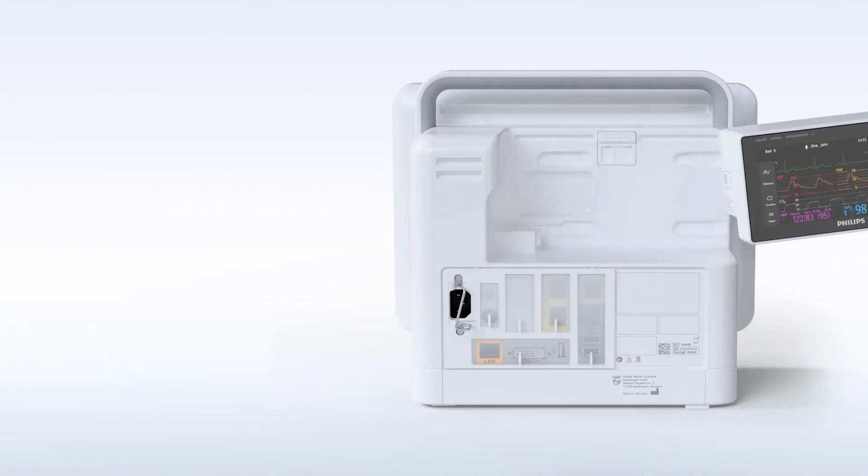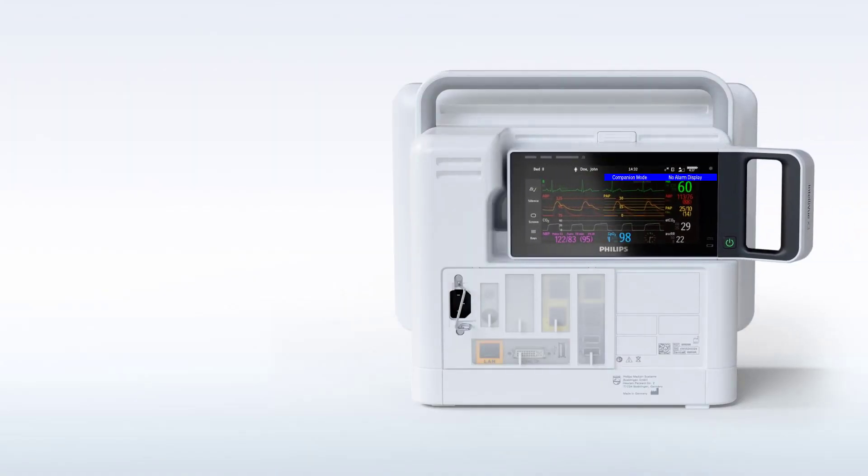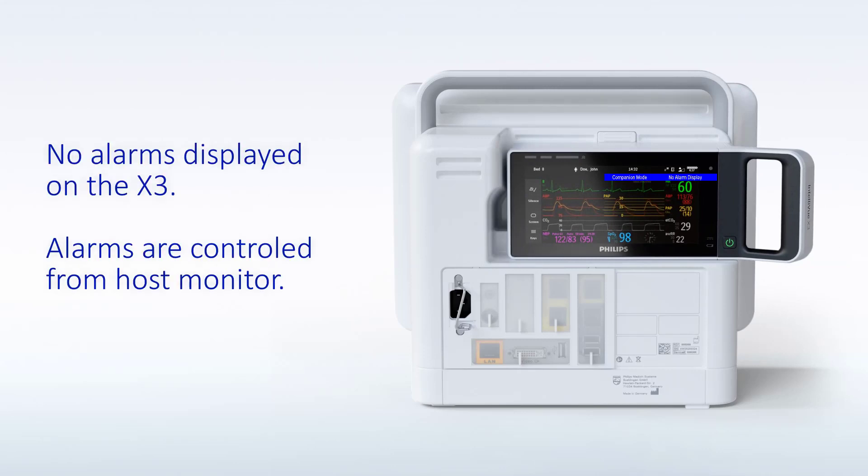When connected to a host monitor, the X3 takes power from the host and meanwhile charges its battery. The host monitor controls the connected X3 — there are no alarms available on the X3, and the alarm lamps are controlled by the host too. You will recognize that the screen on the X3 displays a blue bar containing the text 'companion mode and no alarm display.'